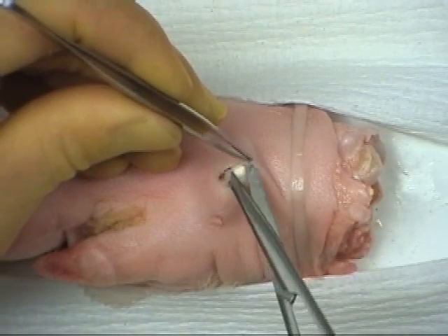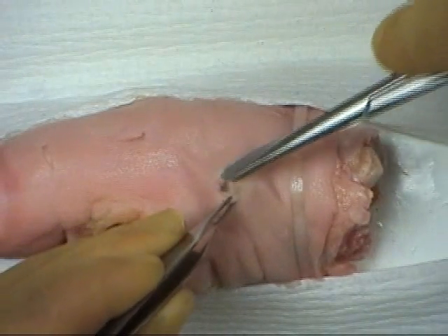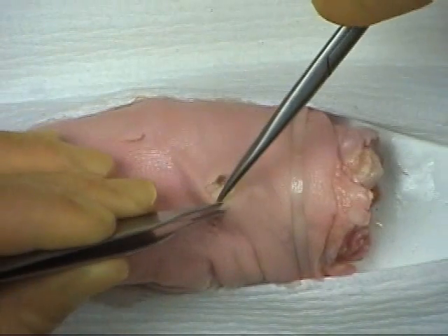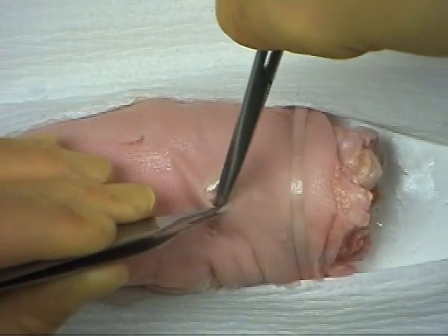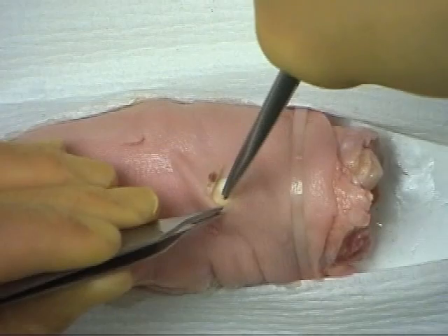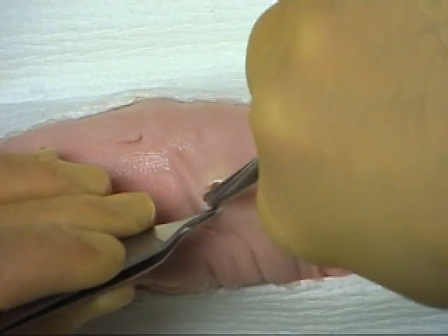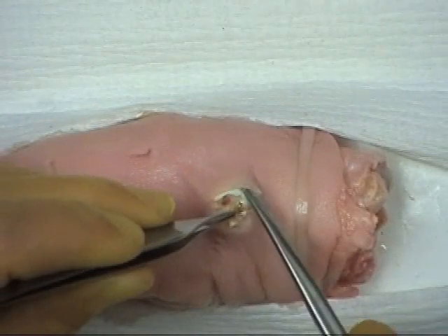Curved Mayo scissors are then used for careful lateral dissection. Care must be taken to dissect the surrounding tissue away without opening the cyst.